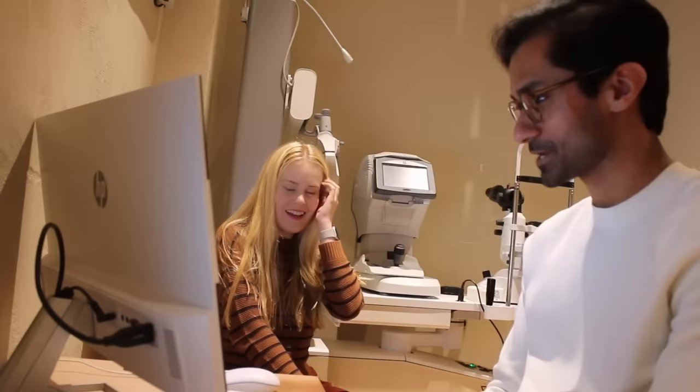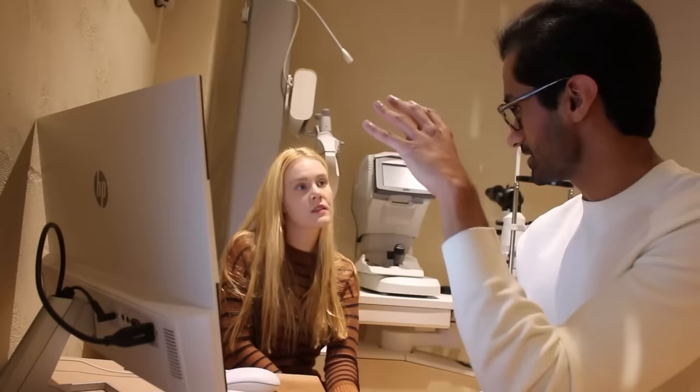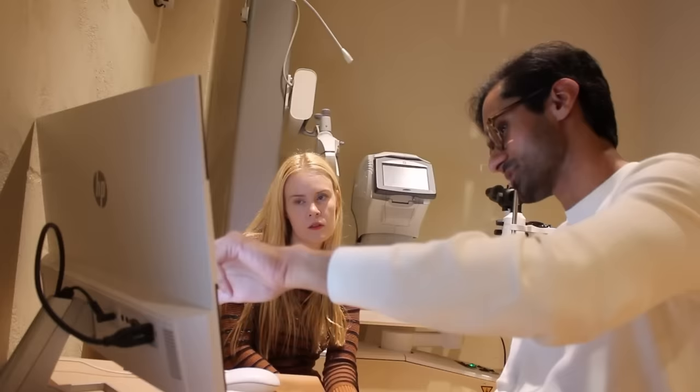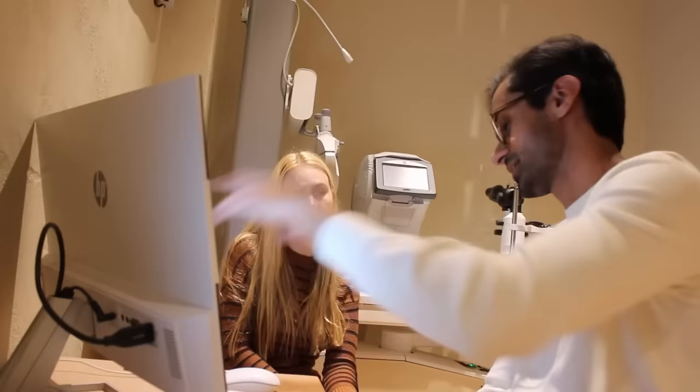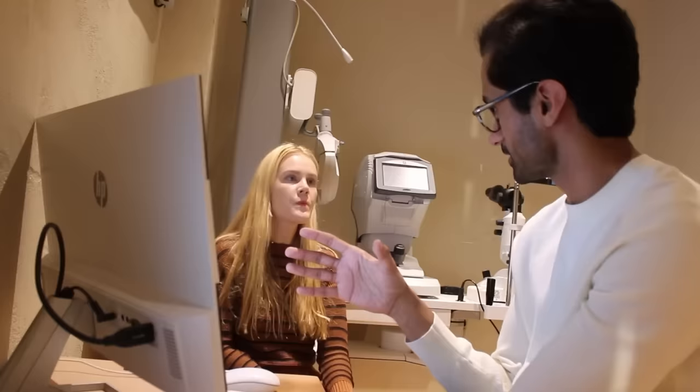What does the axis bit mean? So axis, it's a good question actually. When you have an astigmatism, if you imagine a clock face, it's the angle that we put the lens into your glasses or a contact lens. So if all of these numbers were to stay the same next time you came in, and that 45 changed to a 65, it's basically like I was just rotating your lens. That can also make things snap into place a bit better. Today we've got nothing really to compare it to, so no real concern, but just something to keep an eye on in the future.